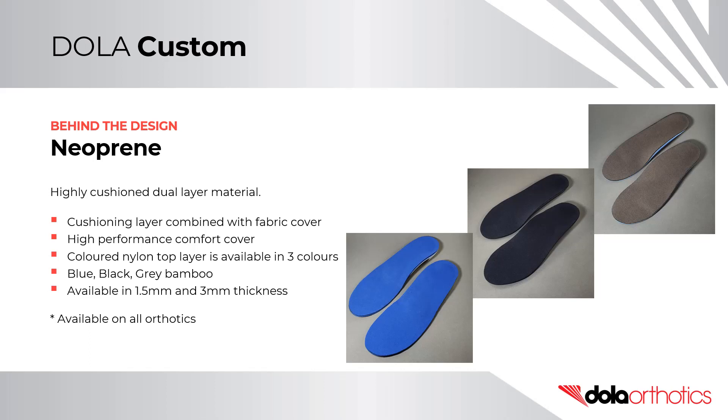Neoprene is a highly cushioned, dual-layer material, combining a cushioning layer with a fabric top cover. The coloured nylon top layer is available in three colours: black, blue, and grey bamboo. It is available in both 1.5mm and 3mm thicknesses, and is available on all custom and prefabricated orthotic devices.